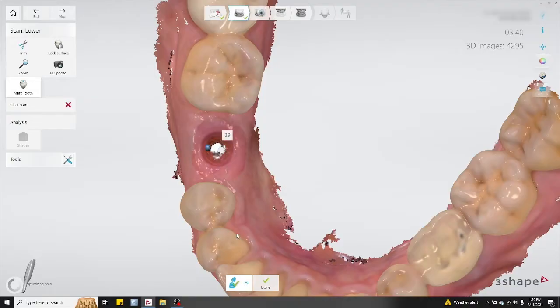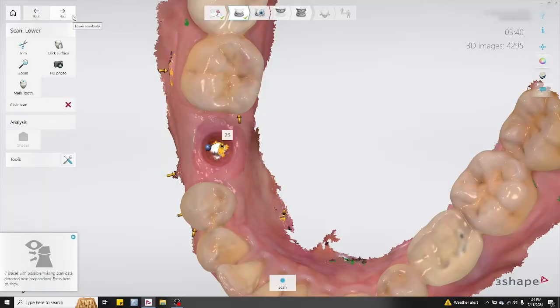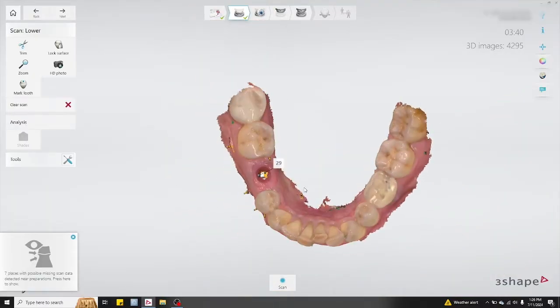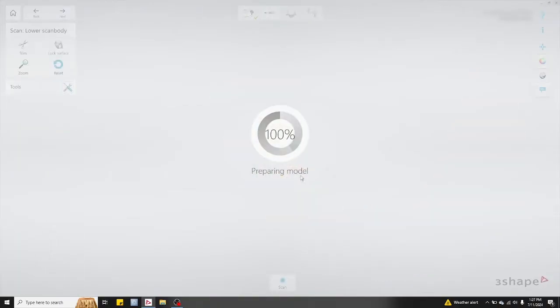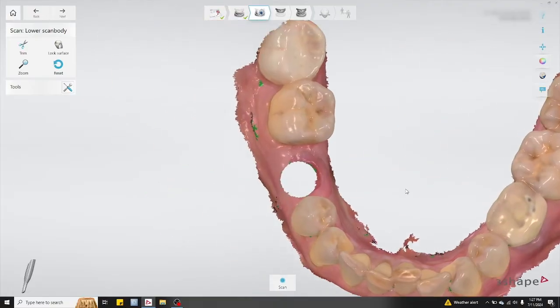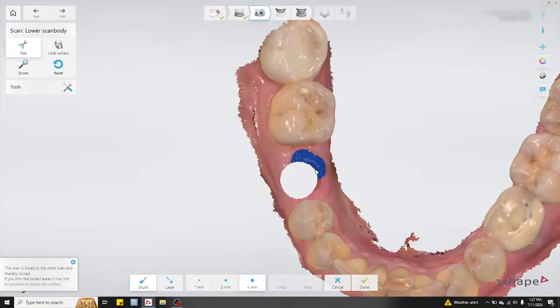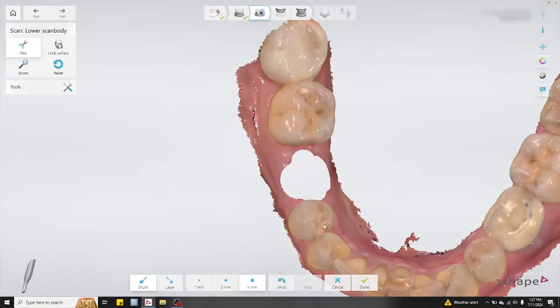Then click on mark tooth and click on the soft tissue in an area that's close to the implant. Don't click directly on the center where there's missing data, as the software is not going to recognize that area. Once you've done that, hit next to move on. In the next scan, based on where you've clicked on the soft tissue, the software will cut out a portion of the soft tissue in that area — this is in preparation for the scan body scan. If it didn't remove all of the emergence profile portion, select trim and remove the remaining part of that area.